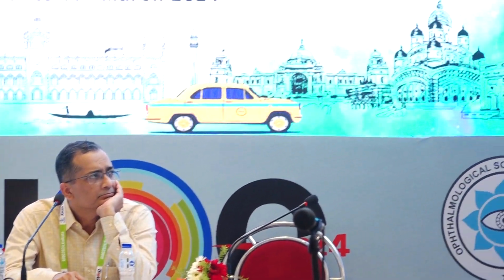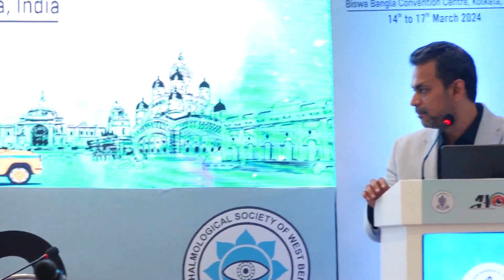Yeah, because here the thing is, when you have to rule out a choroiditis versus fibrinous exudation in CSR, in one condition steroid is the treatment, in the other condition steroid is contraindicated. So it's extremely important doing a multimodal imaging in the kind of cases which I have shown initially, misdiagnosed to be a fibrinous variant of CSC and then turned out to be a Harada's disease, or vice versa.